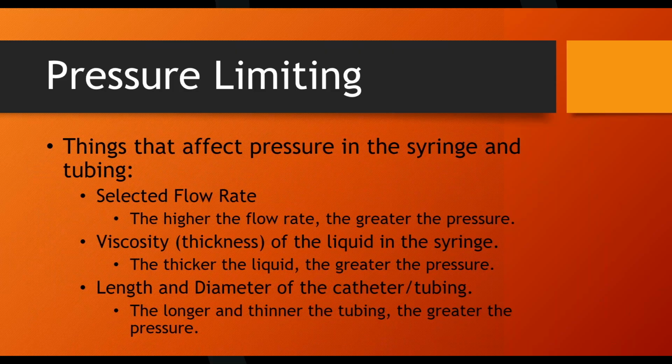For a lot of procedures, these things have been around since like the 60s, and technology has really increased to the point that a CT procedure that even 20 years ago took like 10 minutes now takes 30 seconds. So the system's not sitting out there with the contrast at room temperature as long as it used to. A lot of places don't have heaters just because their systems are so quick, bang, bang, and it's over very quickly. The fluid just doesn't have time to cool off.